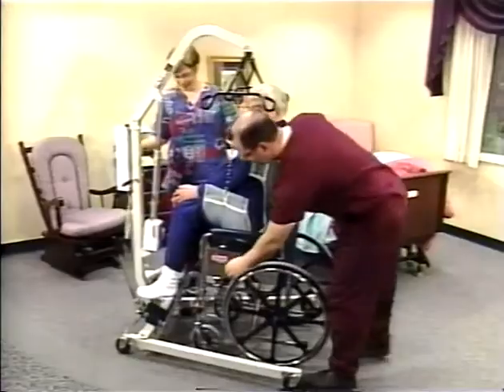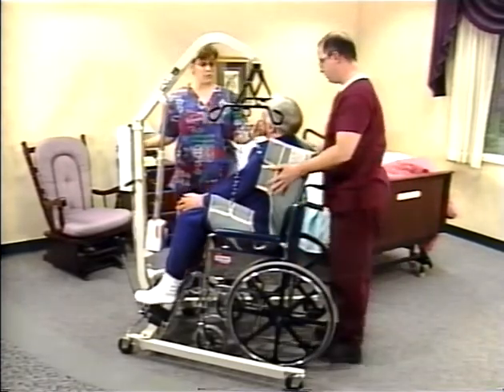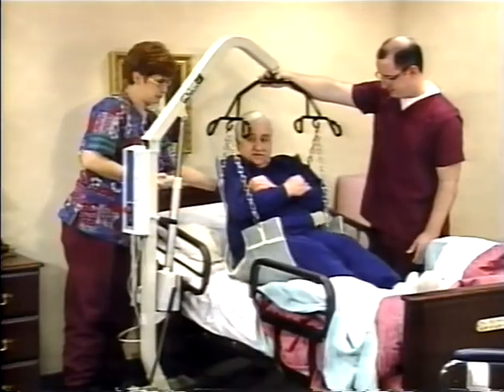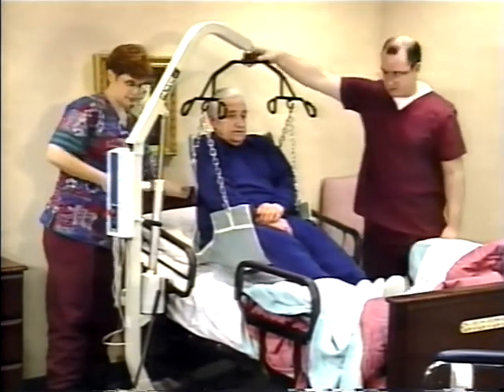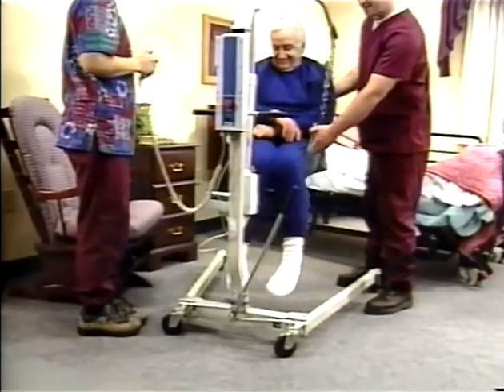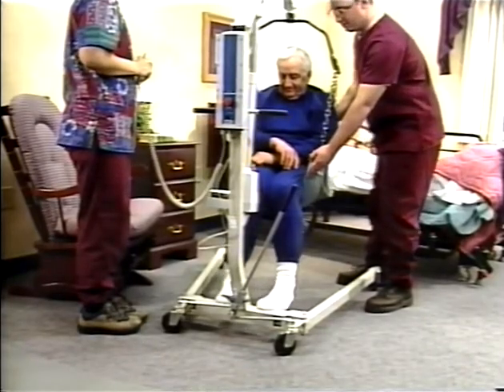When transferring to a wheelchair, bring the chair as close as you reasonably can. That reduces the time your resident is up in the air. He'll appreciate that. Another important safety rule is never lift someone higher than necessary. A lower center of gravity reduces risks and makes a more stable and secure lift.